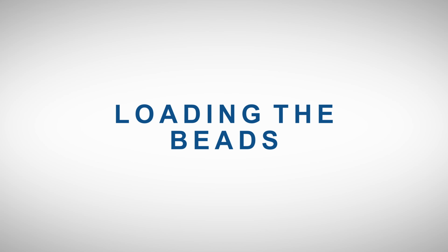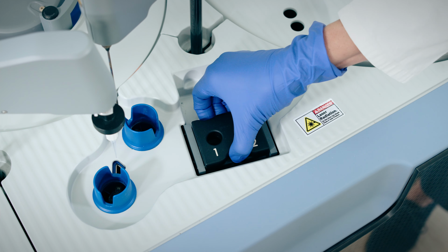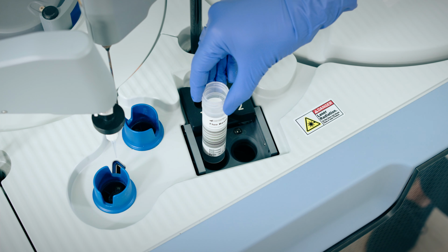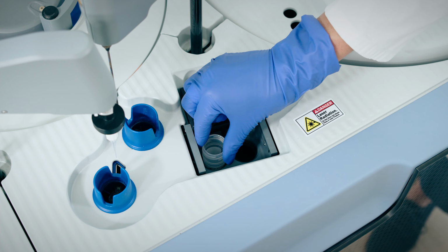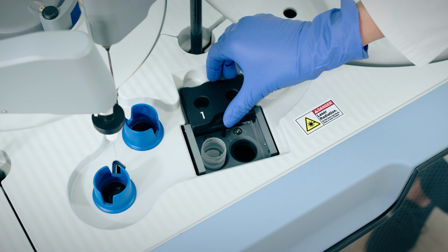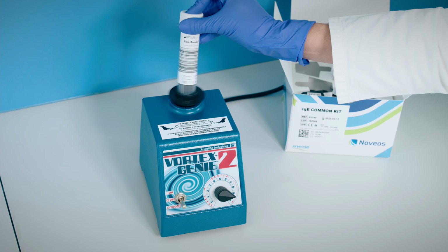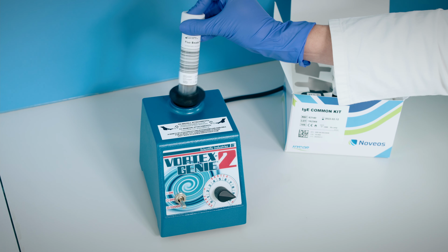Loading the beads. Here you can see where the beads are loaded. The NOVEOS has room for 2 tubes. It is important to vortex the beads before loading them into the NOVEOS.